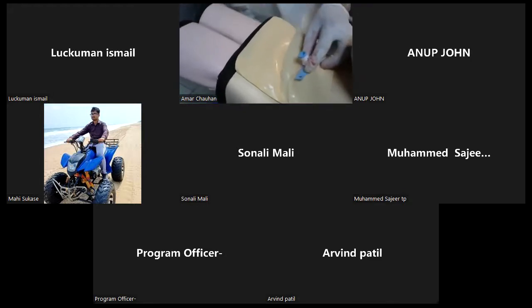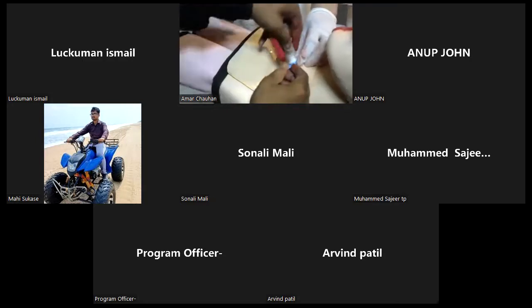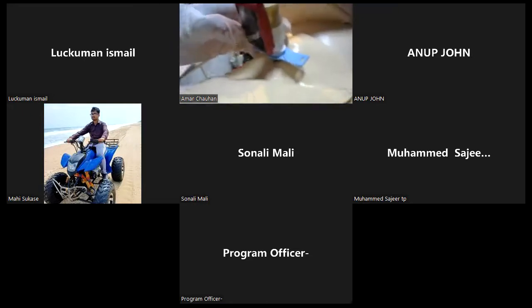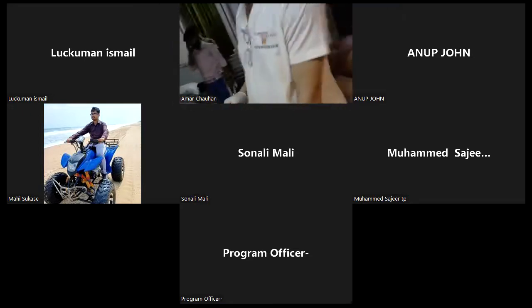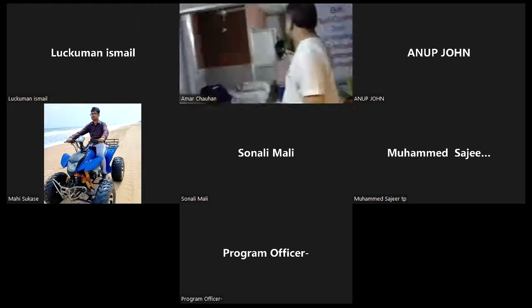We have the EtCO2 simulator also. Once you attach that, it will show a capnograph. The battery is discharged, but we will demonstrate sometime later on. Okay, so what next? We will demonstrate IO access now.